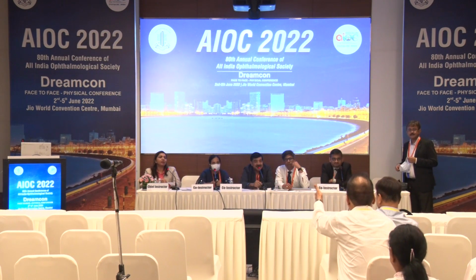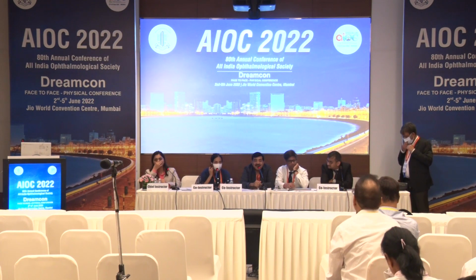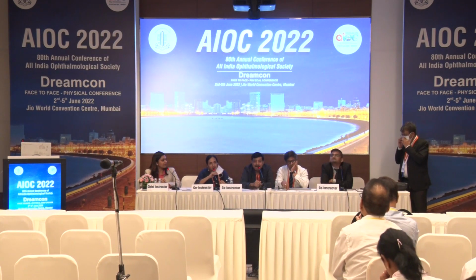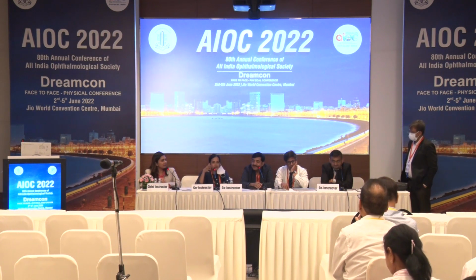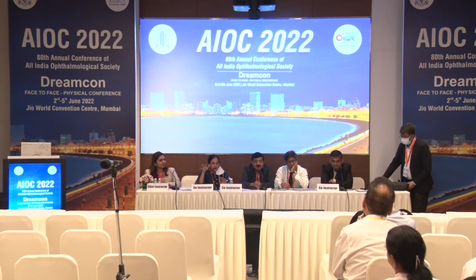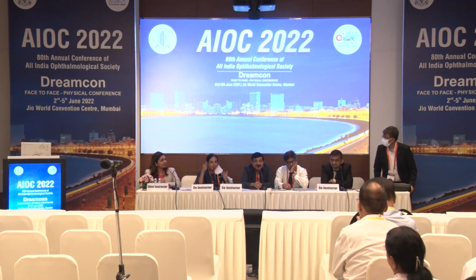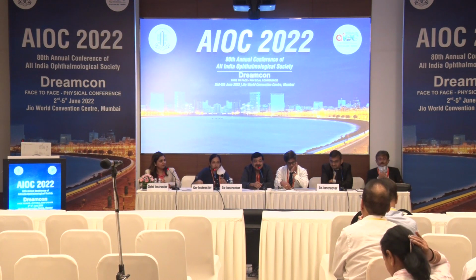I'm thinking of that. As with every other complication, I've had this, though not very frequently. As we were discussing, 2.5 is a very gross astigmatism, but we will see many who will have 0.75 or maybe 1 also. So first thing, like Dr. Bhaumik said, don't be very enthusiastic on day 1, telling them everything and correcting everything on day 1, unless it is something like a 90-degree rotation you can see.